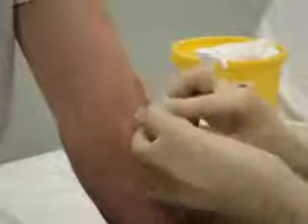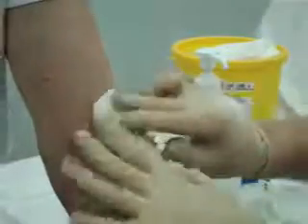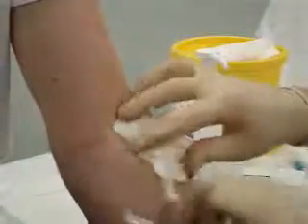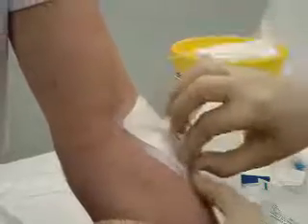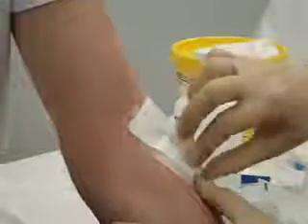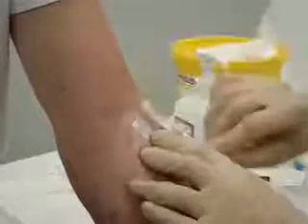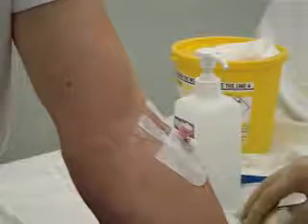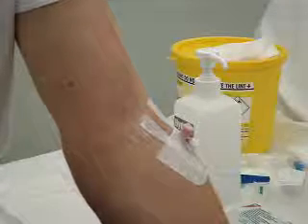And then it gets stuck down. These are sterile dressings that can then be taken off nice and easily. There are also different ways to take them off, and each one has a slightly different method, so I'm just going to put that there. And as you can see now, the cannula is in position quite nicely, and the final thing that's left to be done is to flush the cannula with some saline to check it's in position.